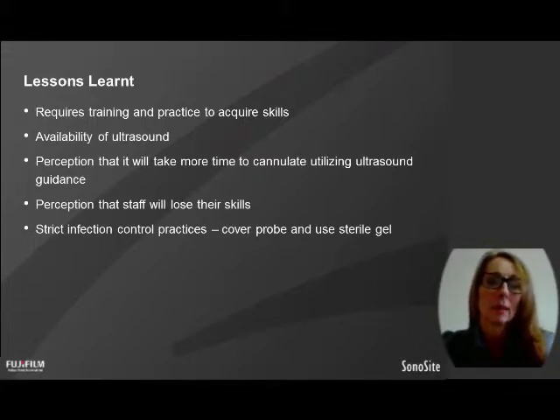I find that there's a perception that it will take more time to cannulate utilising ultrasound guidance. This quickly goes once you get the staff trained and competent. They quickly realise that they don't have those multiple cannulation attempts that you used to see. You think it might take a little bit longer to set up the ultrasound, but if it means that you get the needle in one time with little fuss, you actually get the patients on quicker, and the patients very quickly realise that they're not having multiple attempts, they're not being delayed, they're not having to come back the next day if there was a missed cannulation or go back to their central line.